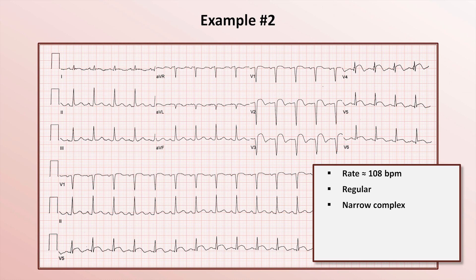It is narrow complex. What about the atrial activity? There are P-waves this time, and they appear to have normal morphology — in particular, they are upright in lead 2 and down-going in lead AVR.